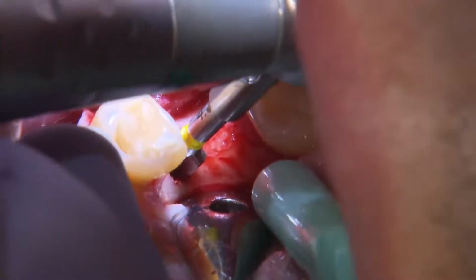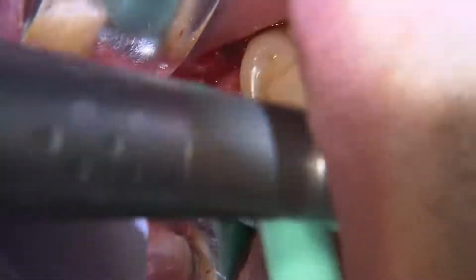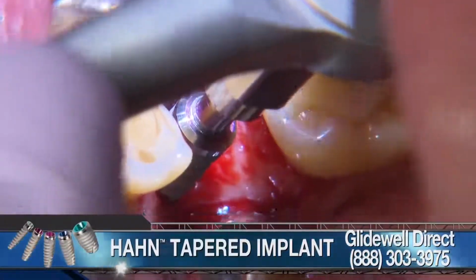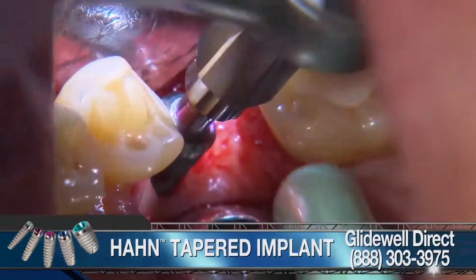So once I'm confident that I've created the osteotomy and it's in the right direction, then I can move forward and place my implant. So there you have a view of where the osteotomy is, and I'll go ahead and load the implant with the implant driver onto the torque wrench, and I'll place that directly into the osteotomy site, and I'll start to thread the implant into the bone.